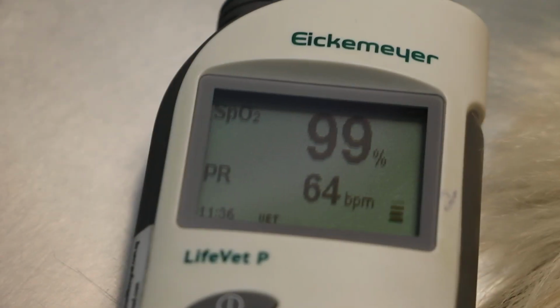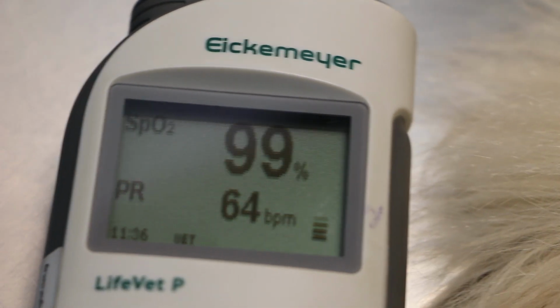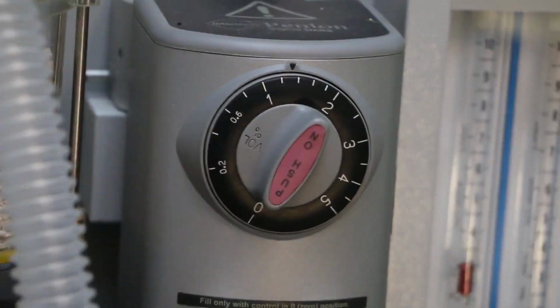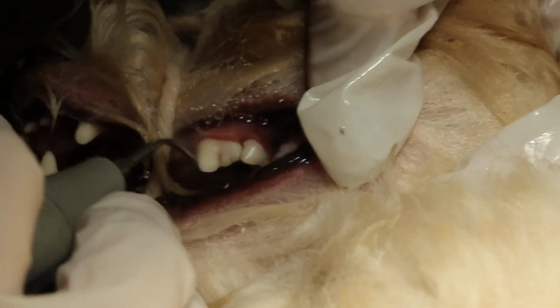How is the pulse? 99% is okay. The monitor, oxygen, and 64 beats per minute. A bit low, but you can see that the dog is still under anesthesia, and we just use minimal isoflurane gas, so it's safer. And because the tartar is not much, it shouldn't take a long time to do this scaling.